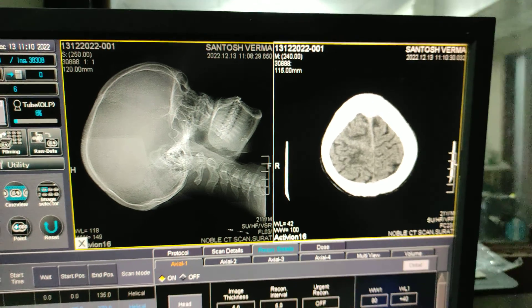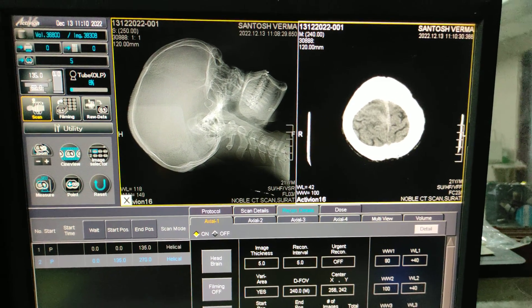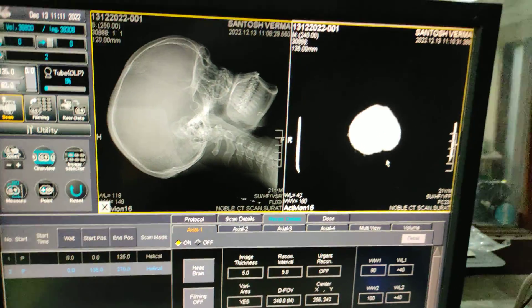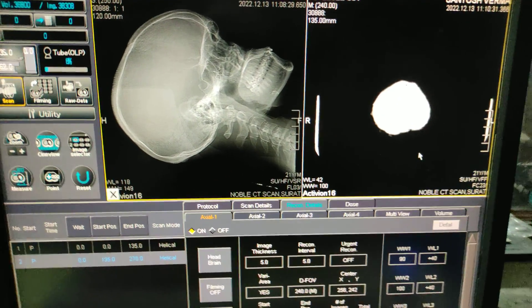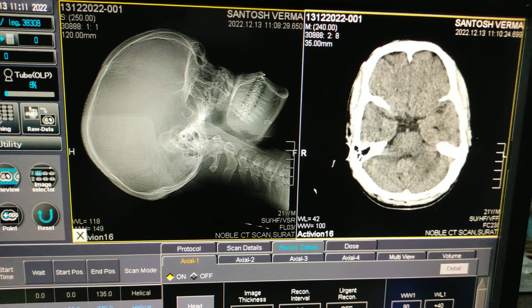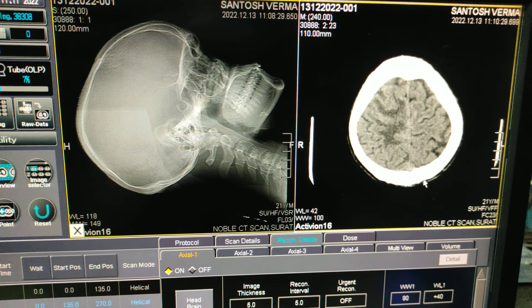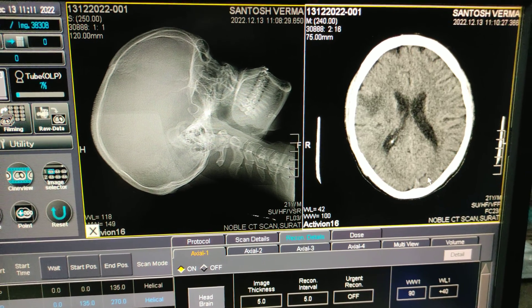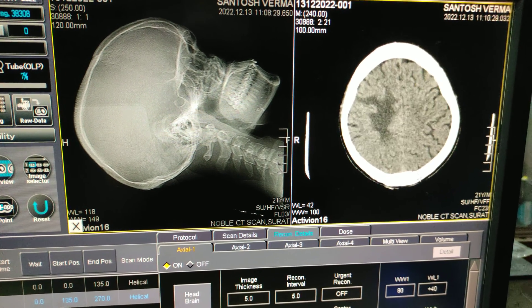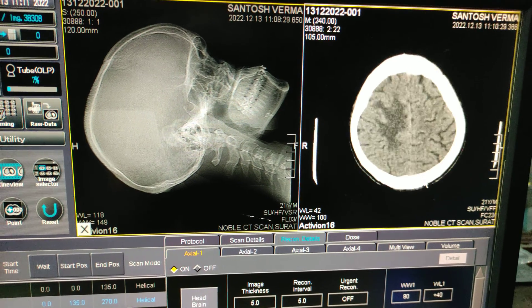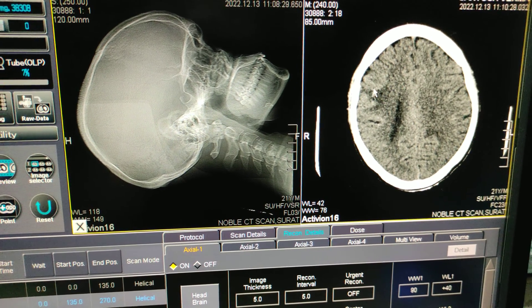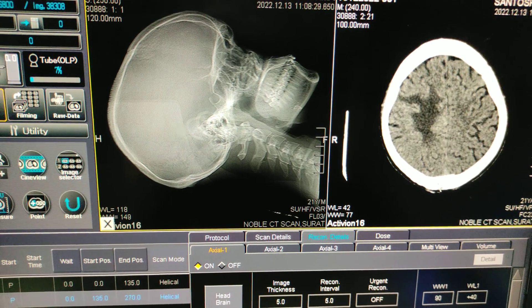Before scanning any patient you have to ask the patient history — what complaint he or she is having. Here the patient is known case of AKD and came for a CT brain. This scan will need a contrast study because here you can see a large hypodense area, which suggests edema. We have to do a contrast study for further evaluation. After contrast we will get a perfect diagnosis — it may be granulomas or multiple granulomas. Here and here are also hypodense areas and multiple lesions that will likely enhance after contrast study.